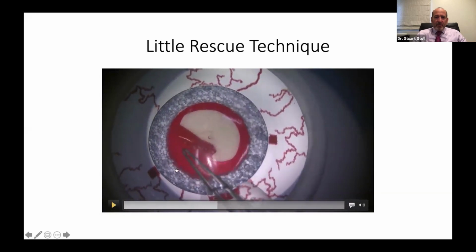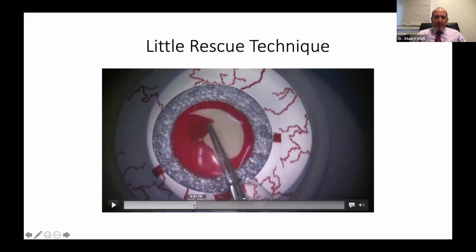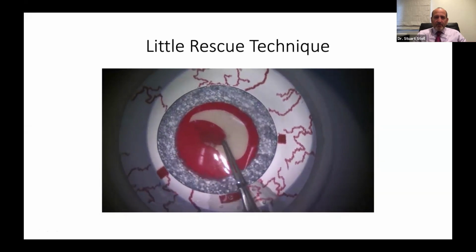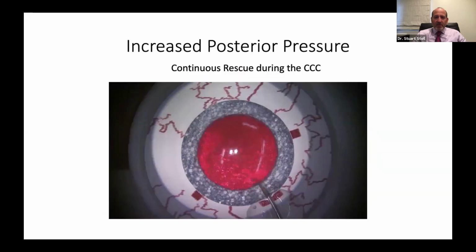Let's stop here. So when we say pull circumferentially back the other way, normally you're pulling this way. So circumferentially back is this angle. You put the tension on, and then as you pull it radially, that's what creates that ripping, tearing maneuver. Watch it here. Bam, there's the rescue. Fold it over with no tension and continue on.